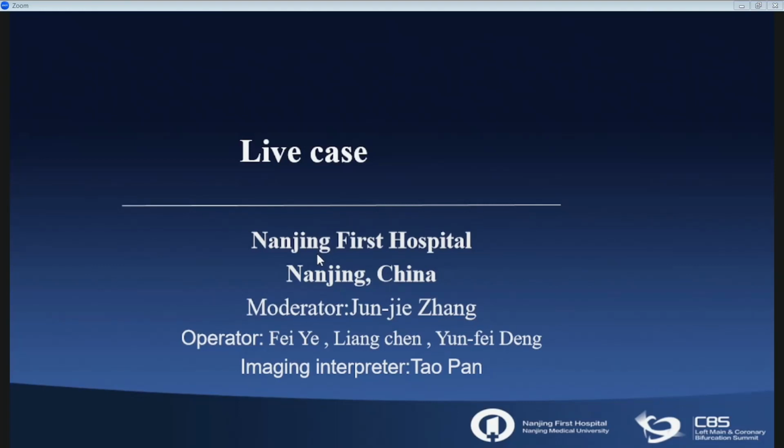Thanks very much. This is a transmission from Nanjing First Hospital. Good morning. Today we will focus on a very interesting case with a CTO lesion and a bifurcation lesion. My assistants, Dr. Chen Liang and Dr. Yun Fei Deng, will assist me to perform the case. And Dr. Chen Liang will introduce the characteristics of the patient, please.